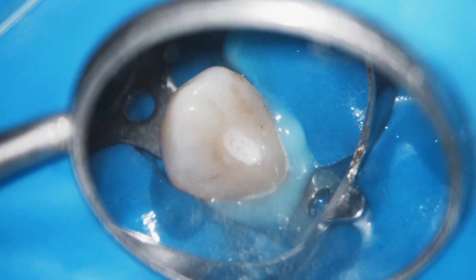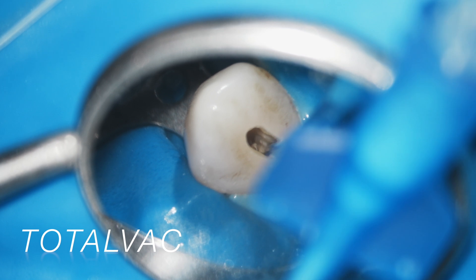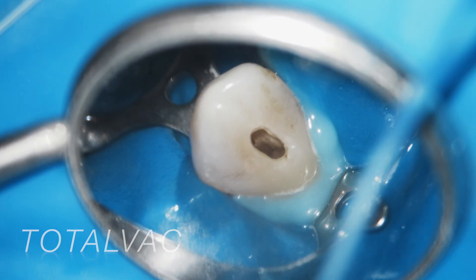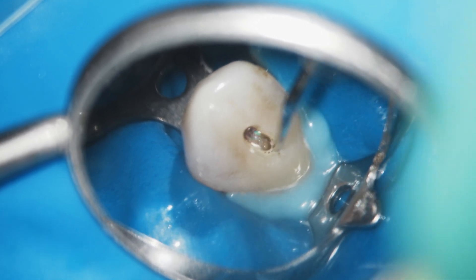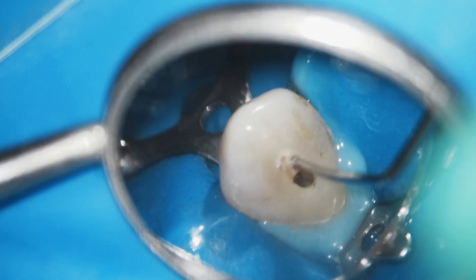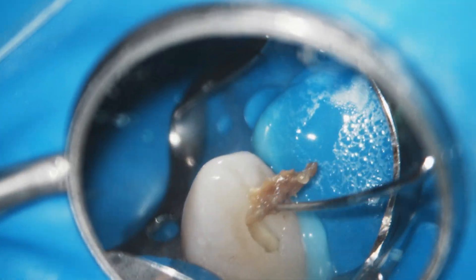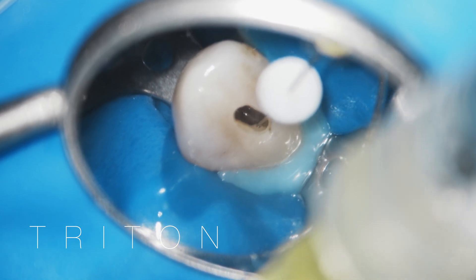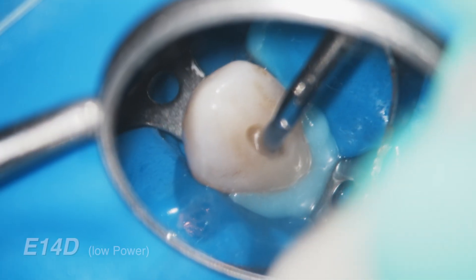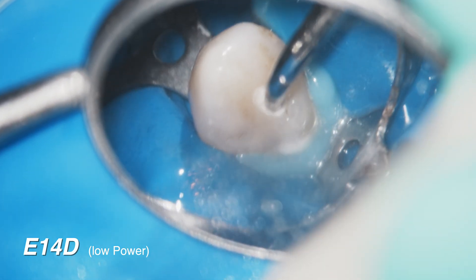You can see the E14D creates a significant soaping and foaming action that is very effective at breaking things down. My Total Vac blue cannula is now removing the fluid and Triton, and you can see it really breaks down and removes the soft portion of both the pulp stone and the necrotic pulp. A little bit deeper we can see additional calcification present. We place more Triton in there and apply the E14D a little deeper at lower power — once again the soaping action is very effective.